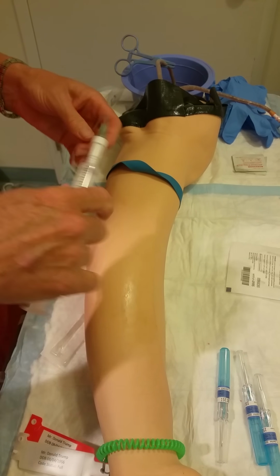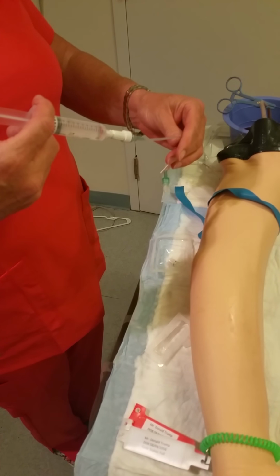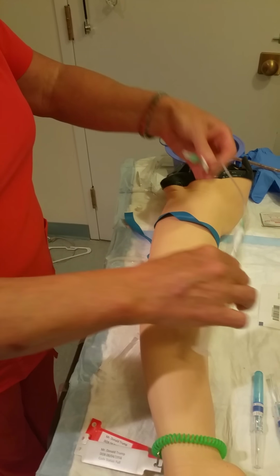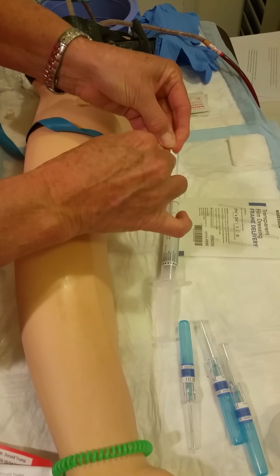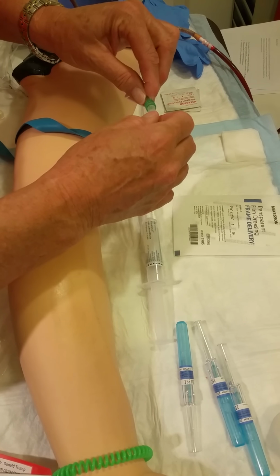My clip is open. I will instill a few drops of saline solution into the extension set, making it into the saline lock. I will close my slide clamp, keeping the device close by for the convenience of my procedure.